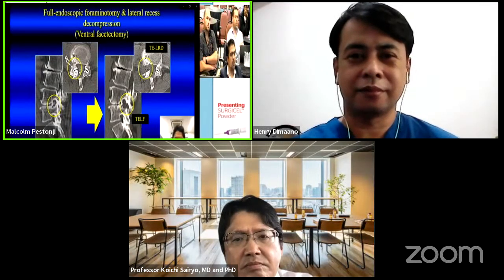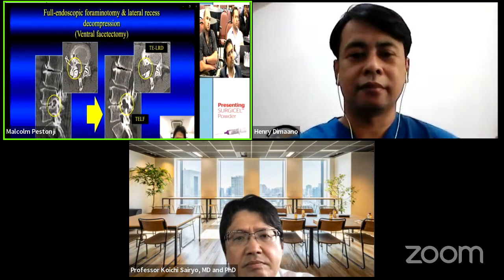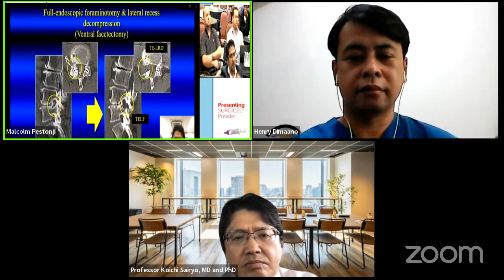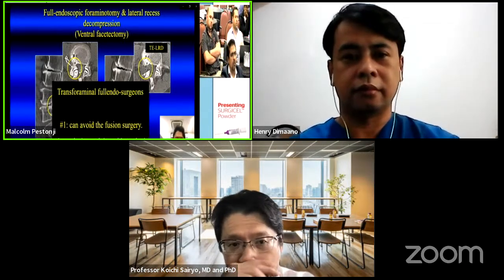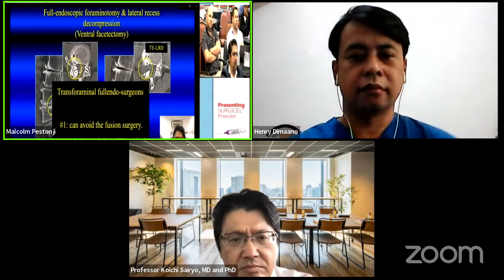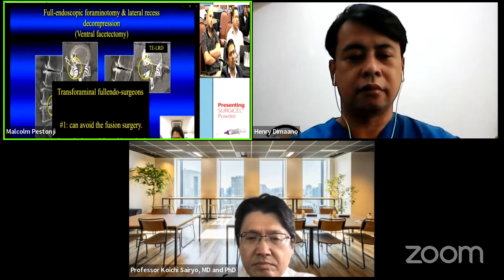However, we are endoscopic surgeons. We can do it without fusion. See here, foraminal stenosis enlargement, recess stenosis enlargement. So after surgery, this patient has no leg pain anymore. So we can avoid fusion surgery. We can go beyond the gold standard.